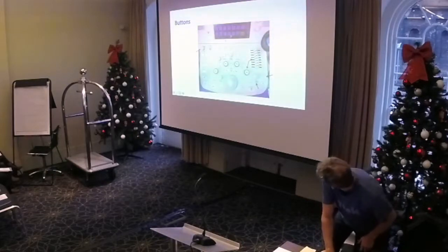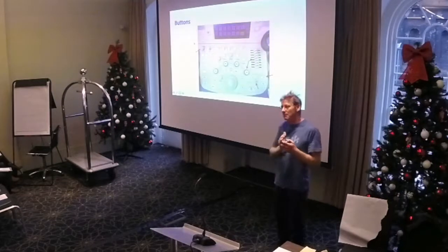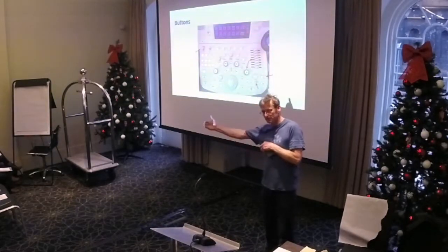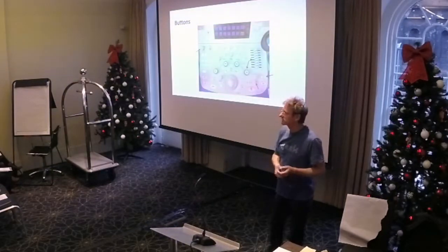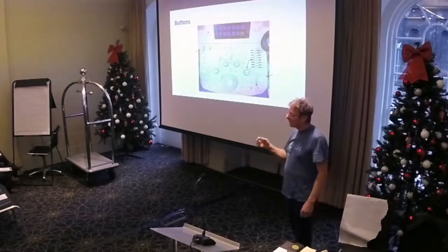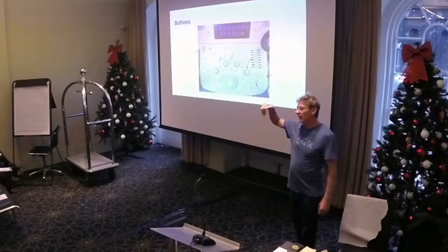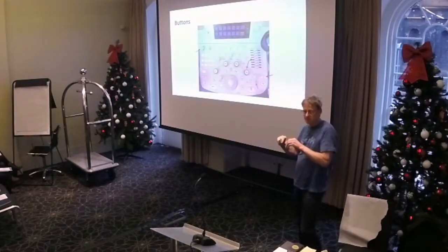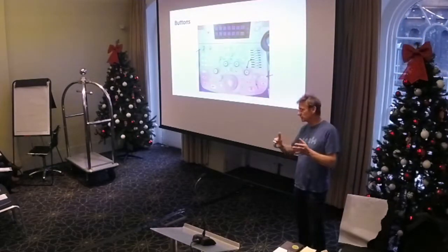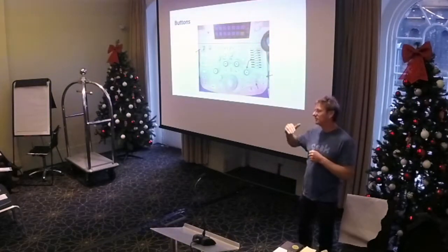So the buttons I'm really interested in here. Oh, have I got a pointer? So power. The power button we rarely use, but the power button is the amount of energy coming out of the scan machine. That's actually how much electricity is turned into sound. Now we don't know if ultrasound is safe in pregnancy. We will never know it's safe because everyone's going to get a scan. But we do know in vitro studies that if you fire ultrasound waves at cells, you can raise their temperature by 1 or 2 degrees Celsius.